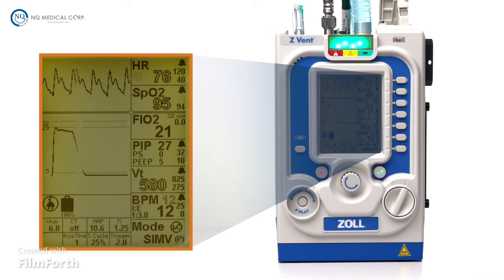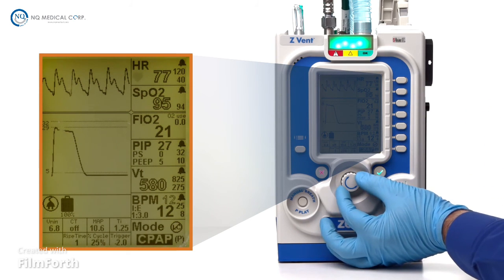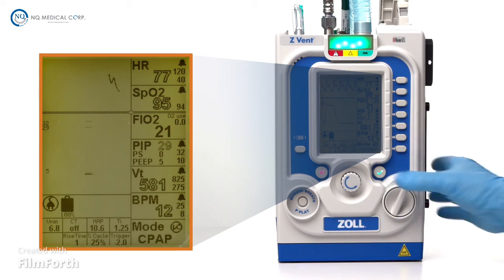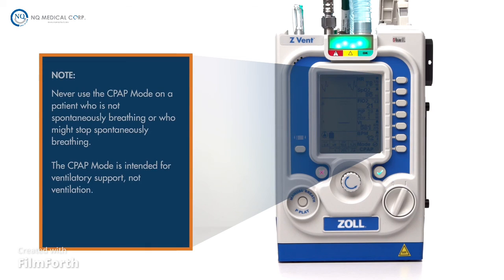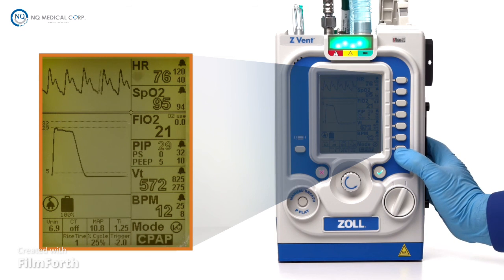In continuous positive airway pressure, or CPAP mode, the patient receives constant positive airway pressure while breathing spontaneously. Never use the CPAP mode on a patient who is not spontaneously breathing or who might stop spontaneously breathing. The CPAP mode is intended for ventilatory support, not ventilation. CPAP can be used with or without leak compensation. When leak compensation is enabled, press the parameter button 3 times to adjust the leak compensation setting.